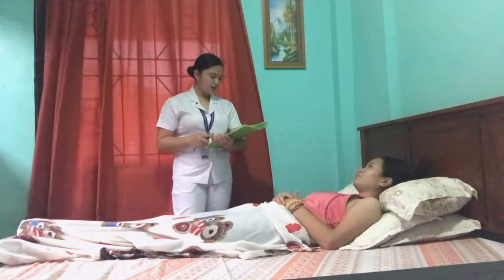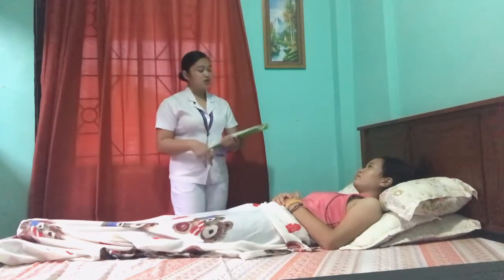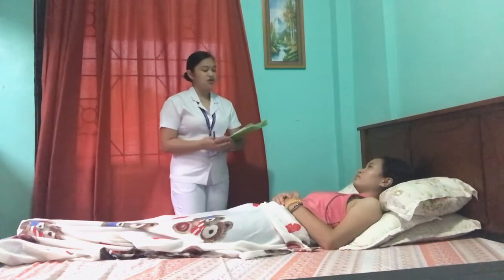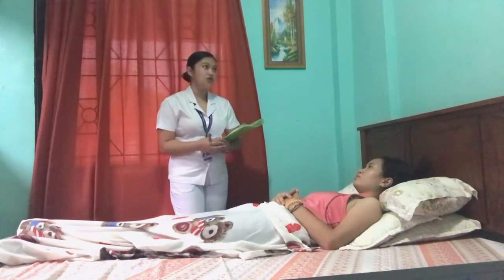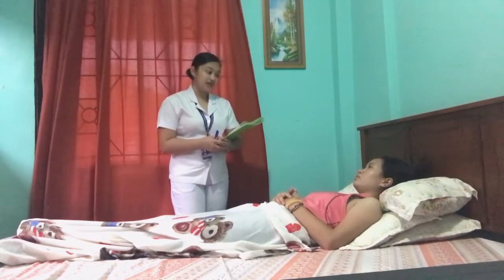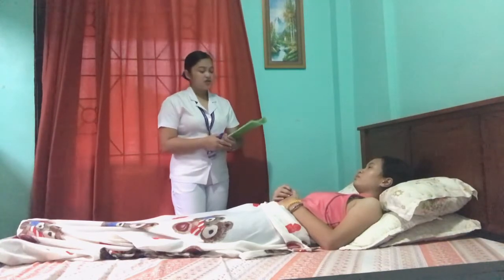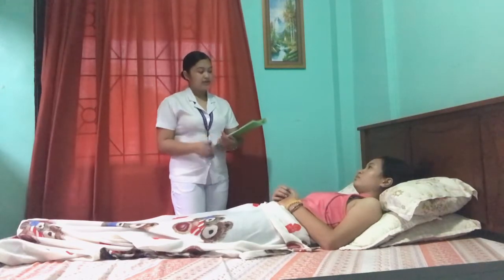Dayan. Okay, ma'am Dayan. So in this administering of medication, we have three processes, which are the intradermal, subcutaneous, and intramuscular injection. But first, we're doing the intradermal injection. It is done for us to know if you have any allergies or to test simply for your sensitivity. So it will hurt a little because I'll be injecting it through the skin of your hand. So I need you to not move while injecting it so that we can prevent any injuries. Is that okay with you?